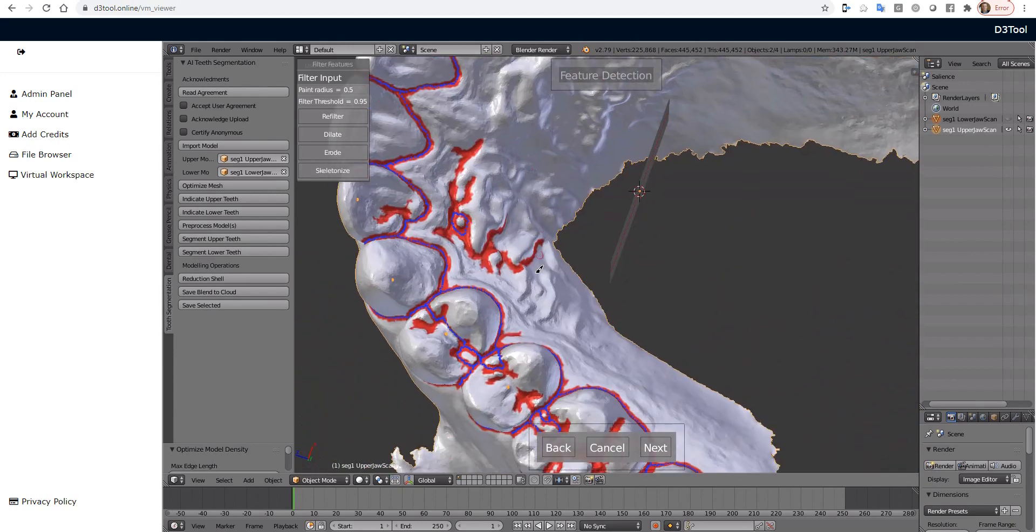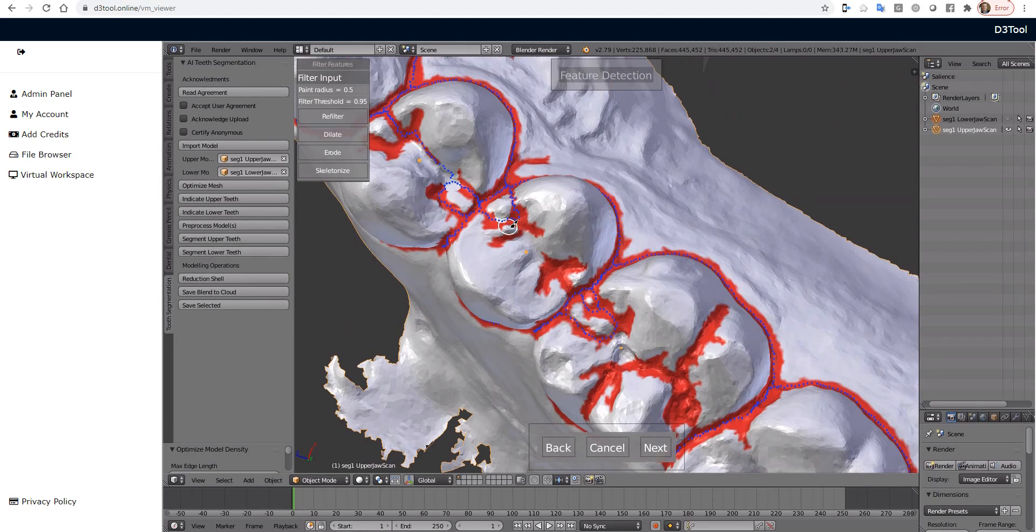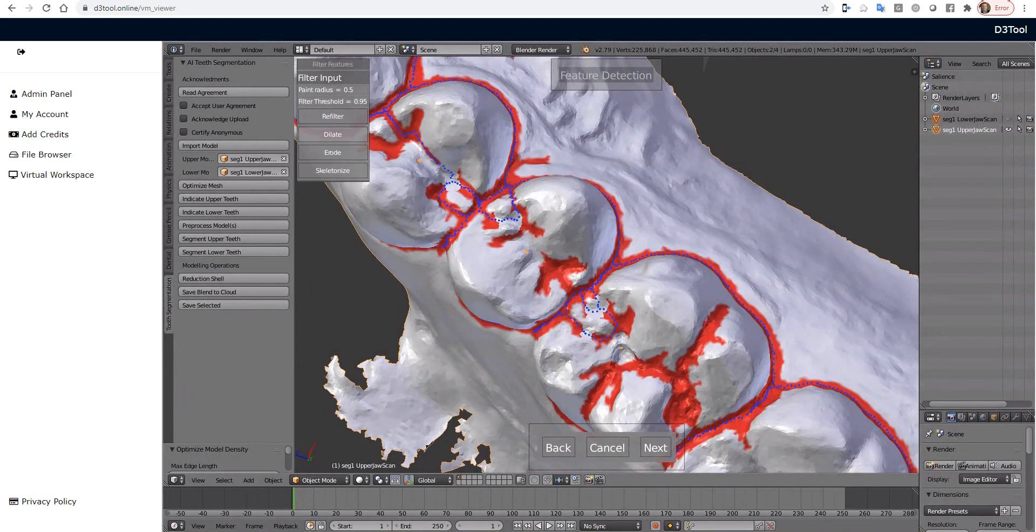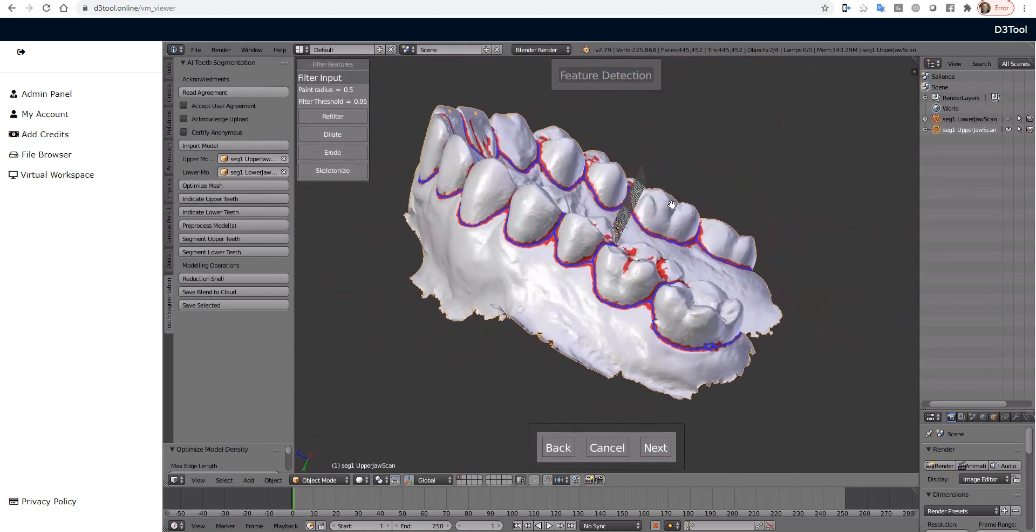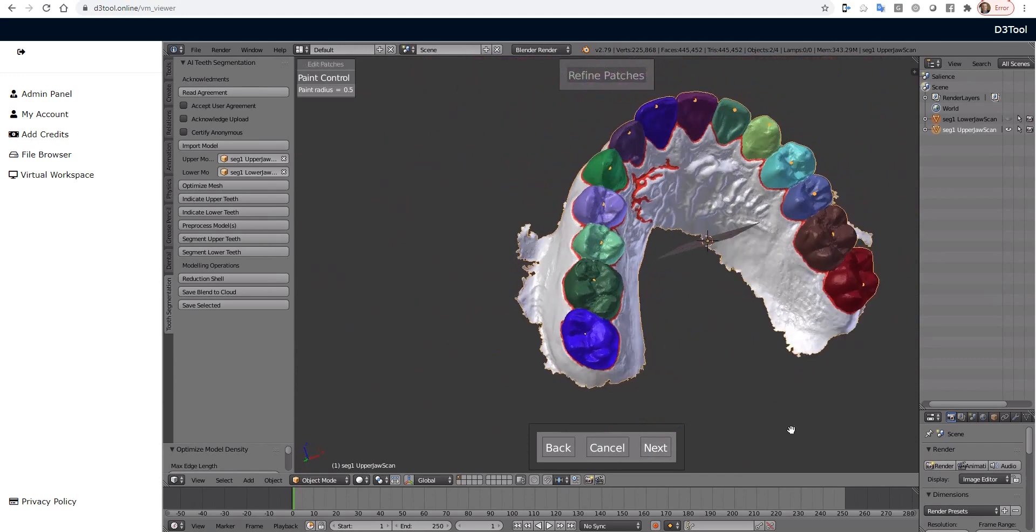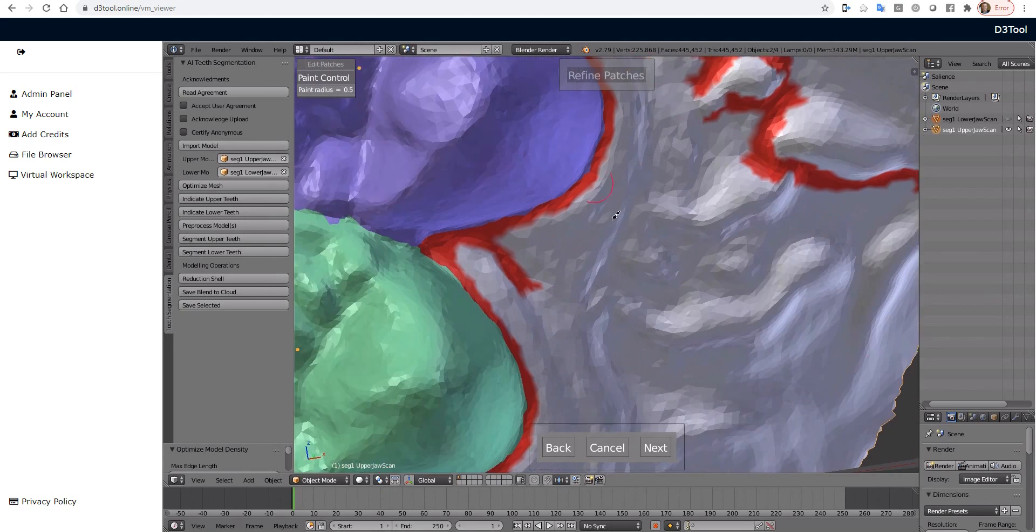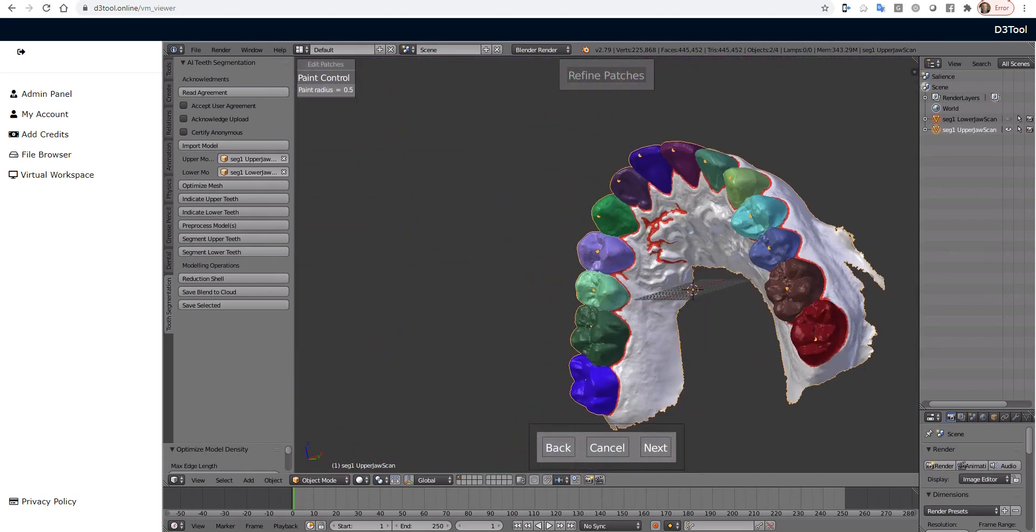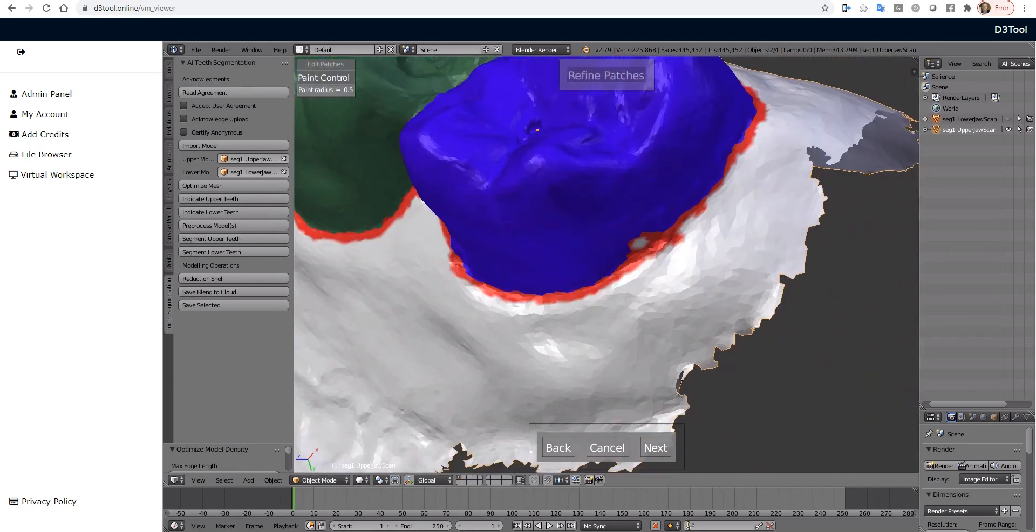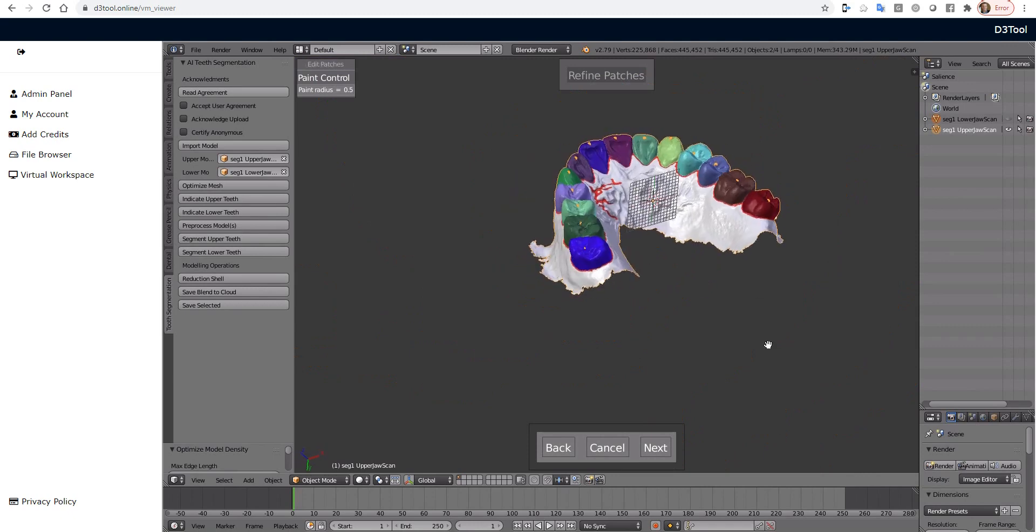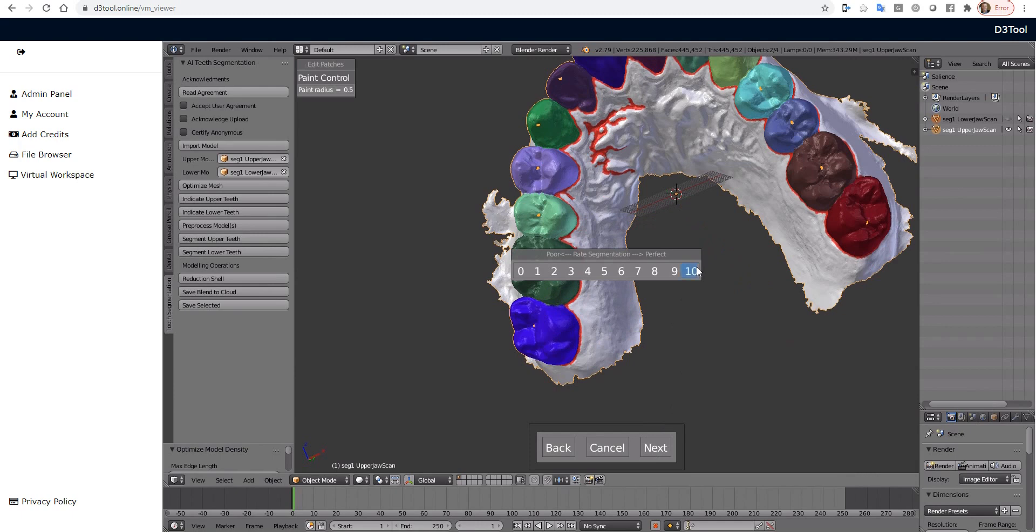OK, this looks really good. Break that up. And there is a user manual for these tools. So you'll be able to do that. OK, so now we've got our segmentation. I'll press Next, and we should get all the teeth individually colored. Looks great. If you needed to make any changes, for example, I think there was one little bleb back here. Yeah. So if you need to add to a patch, start painting in the blue and just paint into the region that needs to be modified. OK. I'm going to press Next. We'll rate our segmentation 10 out of 10 and go on to the next jaw.